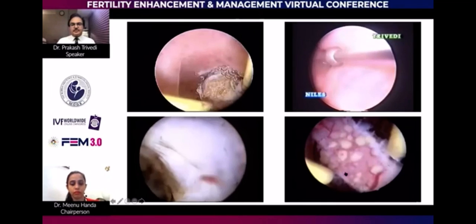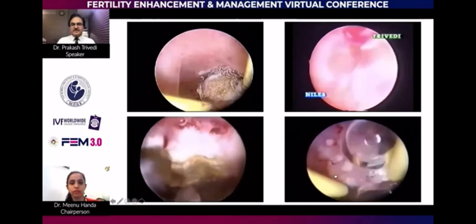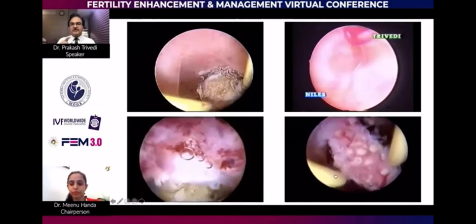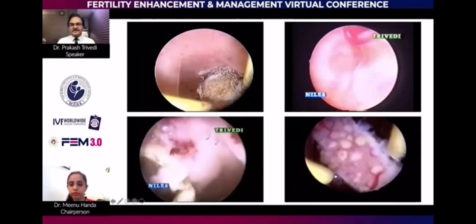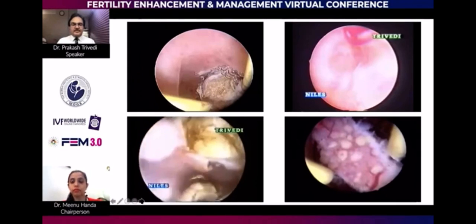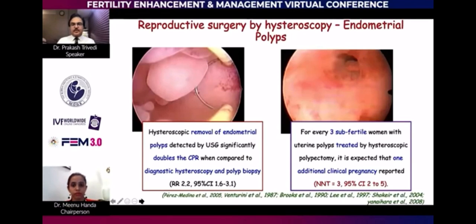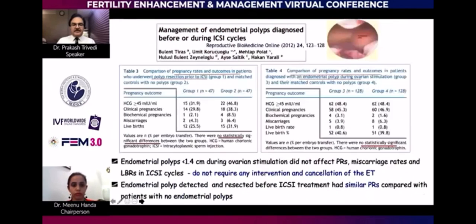This picture — most people would think this is tuberculosis — but this was in a 33-34-year-old patient who turned out to have miliary metastasis. So you have to remember that you can get situations with surprise findings. Cumulative pregnancy rate doubles when you remove a proper polyp, and you can have at least one in three patients achieving pregnancy. This was in relation to ICSI.